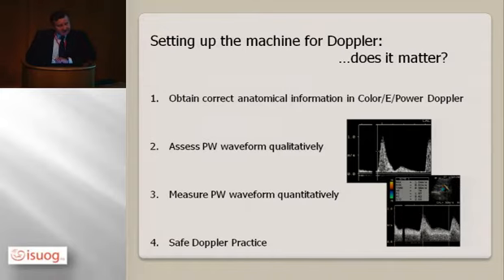I'm also going to talk at the end, the bit that everyone groans about but is becoming increasingly important, safe Doppler practice. Becoming increasingly important, of course, because of the context of using Doppler, and particularly ductus venosus Doppler, for first trimester screening.